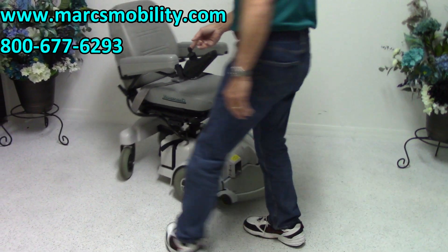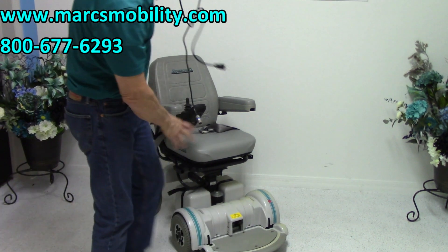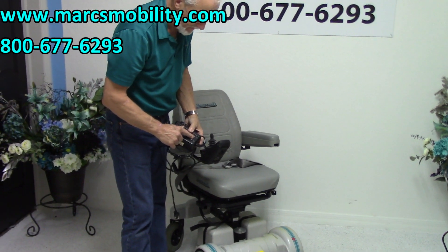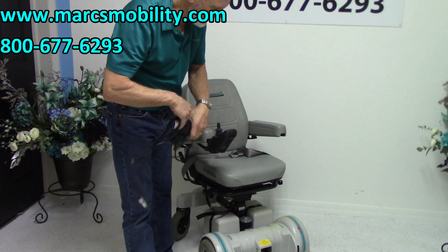When you want to charge this chair, you take your charger and plug it right below your joystick. When the light turns to green, it's fully charged. The charger will stop charging automatically once the batteries are full.